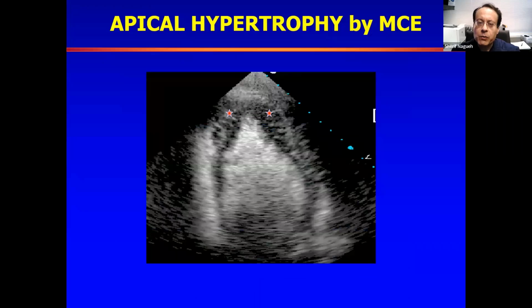More frequently, one needs to use the ultrasound enhancing agents. If you have a case referred with the possibility of hypertrophic cardiomyopathy or EKG findings that raise the possibility of apical hypertrophy, one should have a real low threshold for using ultrasound enhancing agents. They not only recognize the presence of hypertrophy, but they can also identify the presence of an apical aneurysm, or thrombi present in the apex. These have a profound impact on how a patient will be managed down the line.